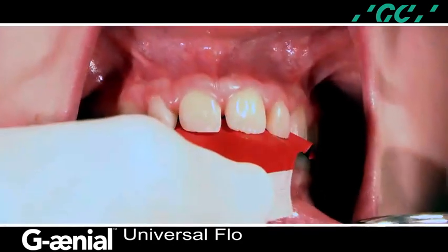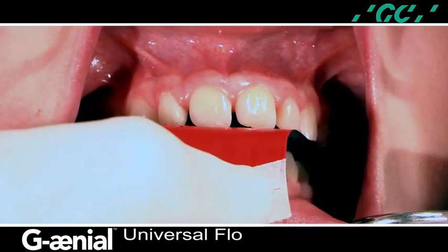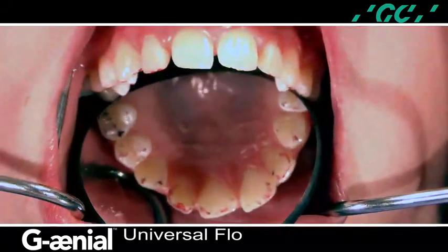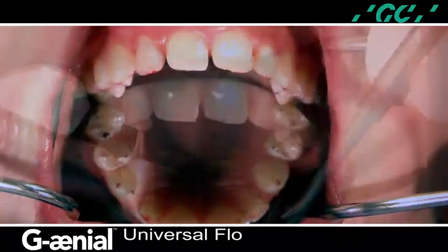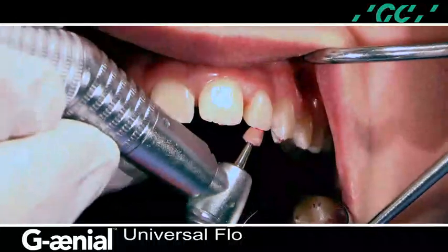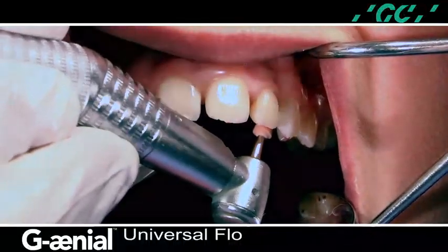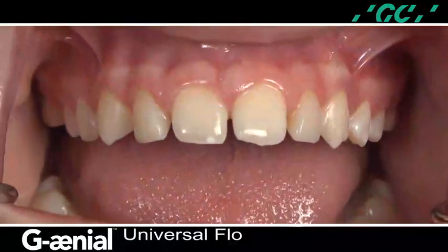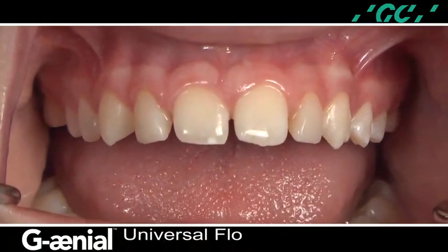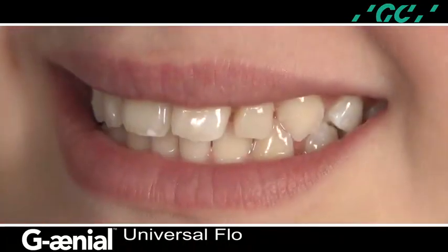Next, the patient performs protrusive and lateral excursions, and the transitional restorations are inspected for prematurities. After the equilibration is completed, the lingual surfaces are polished with a silicone point at low RPMs. The completed polished composite restorations. Notice the harmonious integration of this nanohybrid flowable composite resin with the surrounding natural dentition.